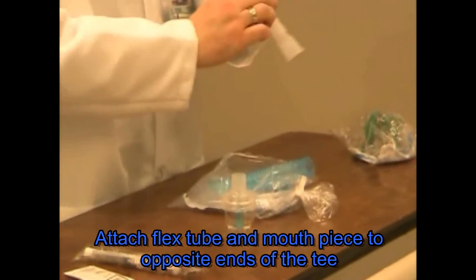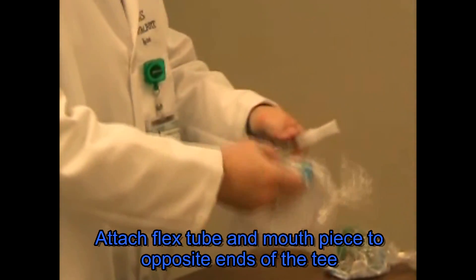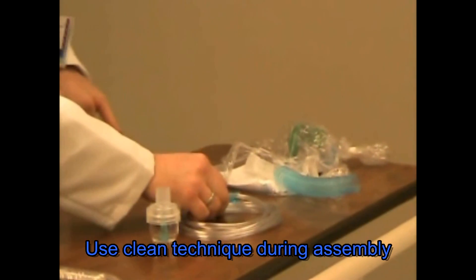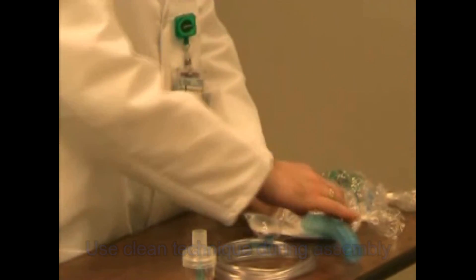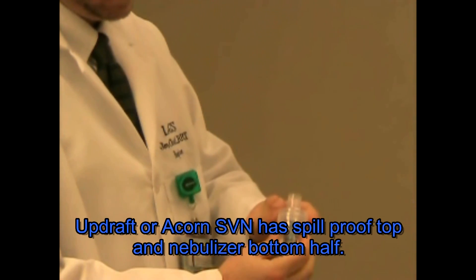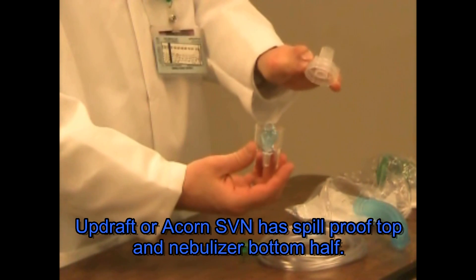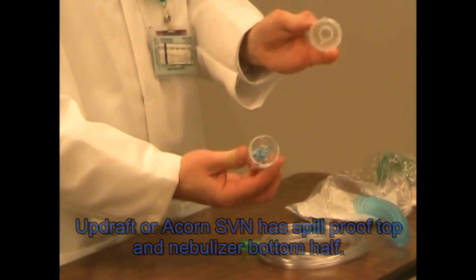Assembly is simple. The mouthpiece and flex tube are attached to a T, maintaining the mouthpiece in a clean condition — try not to touch it or drop it. The nebulizer, in this case an acorn nebulizer, comes in two pieces. It contains a top and a bottom. The bottom holds the nebulizing unit. The top has a spill-proof collar.